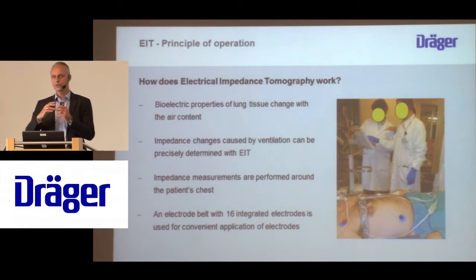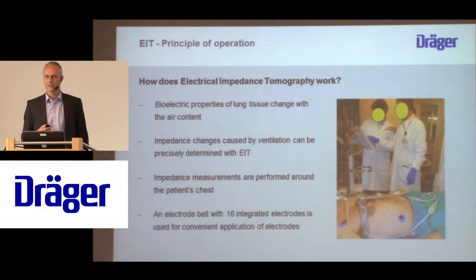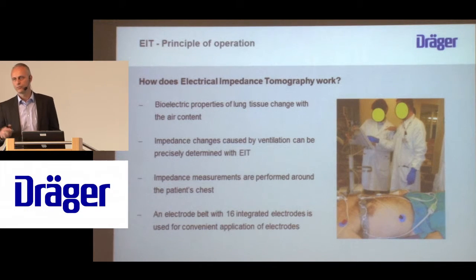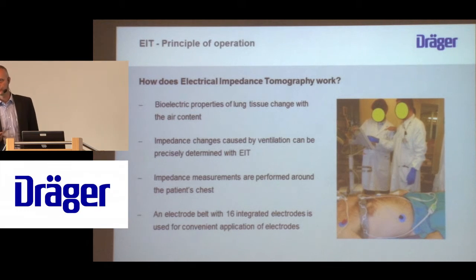But you can imagine if the lung tissue is stretching a little bit during inspiration, then the tissue around it, the pathways are getting a little bit longer and also thinner. And that is actually what increases the impedance. That's also a possible explanation that some fluid is maybe dislocated, and that also might contribute to an increase of impedance.